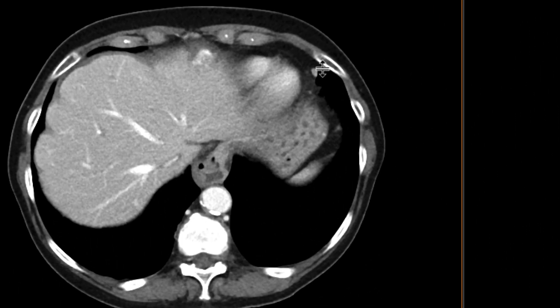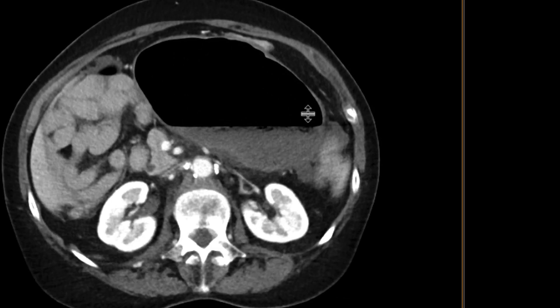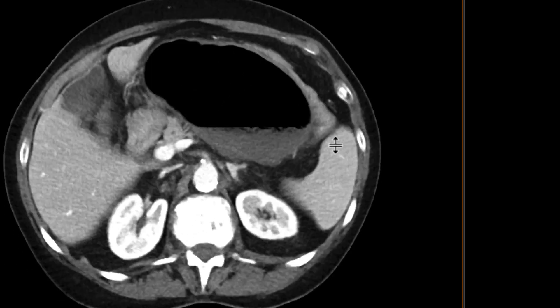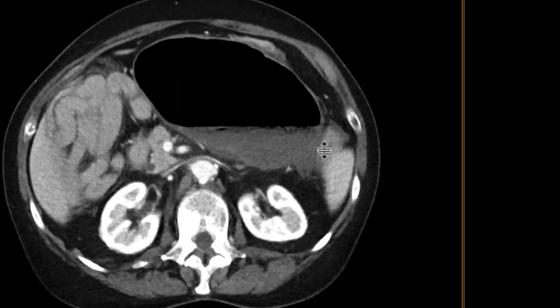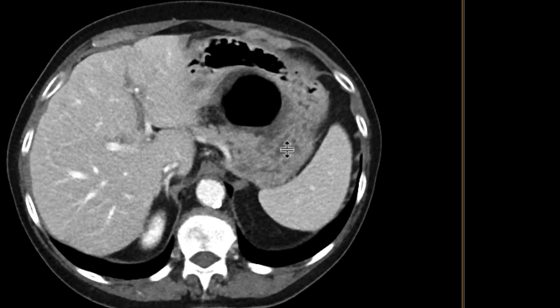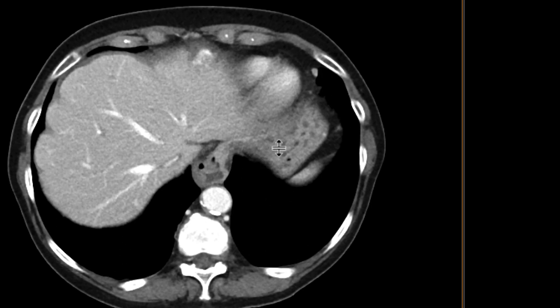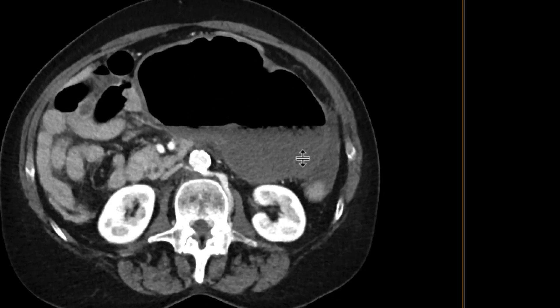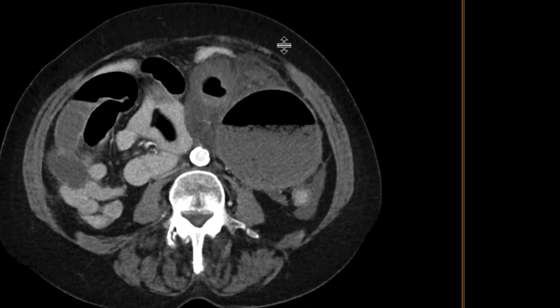This is a patient who comes in with abdominal pain and gets a CT scan of the abdomen and pelvis with intravenous contrast. Scrolling downwards, there's a very abnormal looking loop of bowel in the mid-abdomen veering towards the left side. It's not the stomach, which you can see cephalad to that. This loop has a large air-fluid level and is quite distended. Surrounding it, there's a lot of fat stranding and inflammatory change.